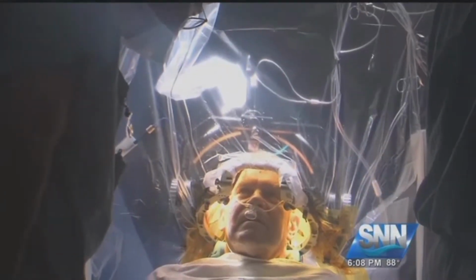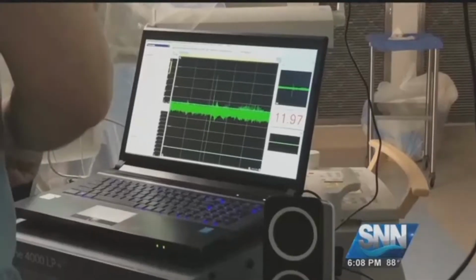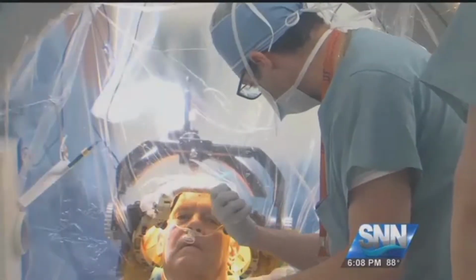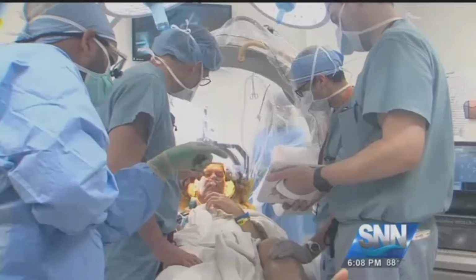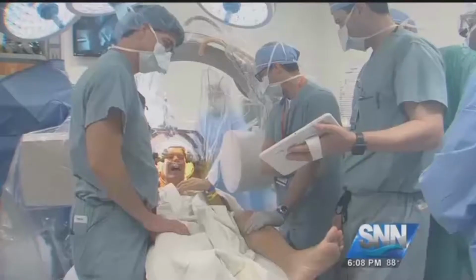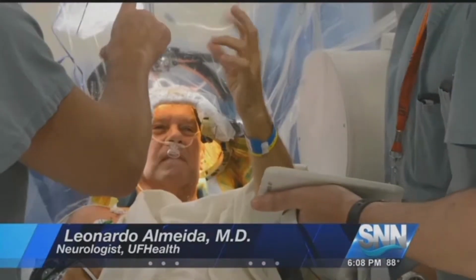The lead is in, and here's why PJ's awake. If you're awake, you know, you can participate, and I think we can maybe get a little bit better outcome. So they turned on the system. Dr. Leo Almeida takes it from here. Count to 5 again. 1, 2, 3, 4, 5. How about your left leg? It stops all of a sudden. Do a little bit of fine-tuning before deciding where to implant the electrode in the final position. Telling them where the lead should be. 1 millimeter in the brain is the difference between Florida and California.